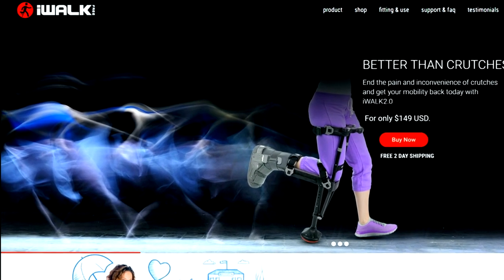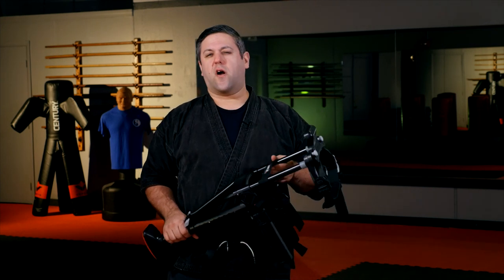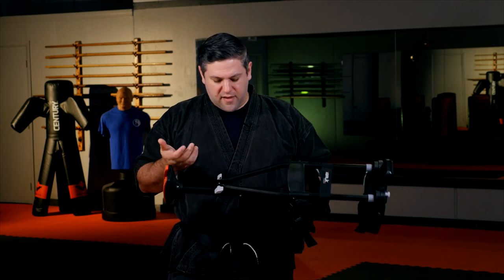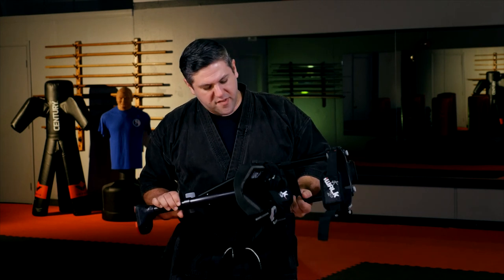My first initial thoughts when I got it: first, of course, it doesn't come assembled — you have to put it together, and it's not too bad. The assembly is fairly simple, although the instructions aren't the clearest. It might take you a few attempts; you might put some rods in place and realize you shouldn't have done that first, and have to take it apart a couple of times. But it's not the worst thing in the world. Overall it should probably take you about 30 minutes.